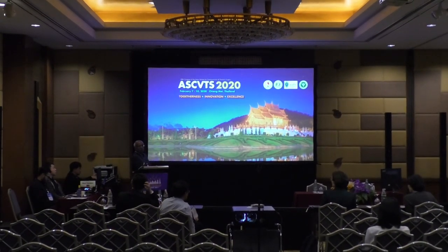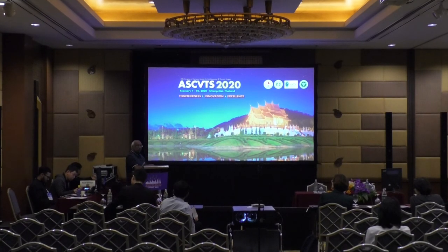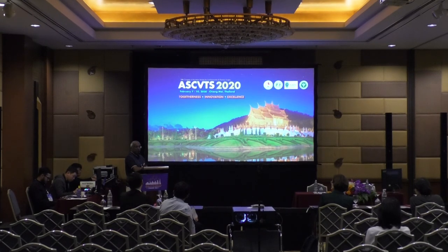Right. So that's why we did this as a first case, because the current Intrepid sizes won't be sufficient in a dilated tricuspid annulus. So they are working on a larger device on the right side. That won't be available for at least a couple of years. But you're quite right. You need something on the annulus right now to put a valve in there, because especially with a big annulus, we don't have an Intrepid of that size. You're right.